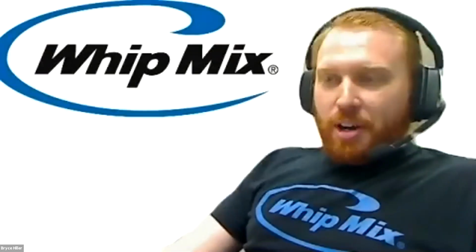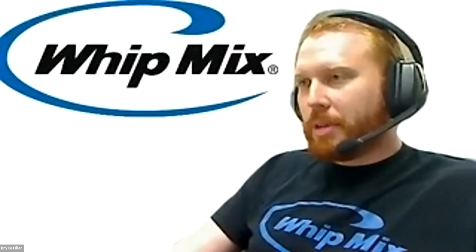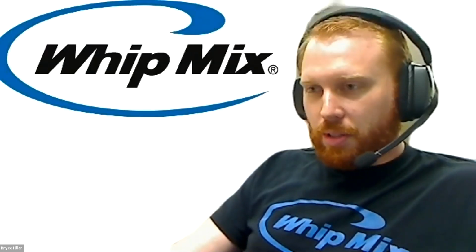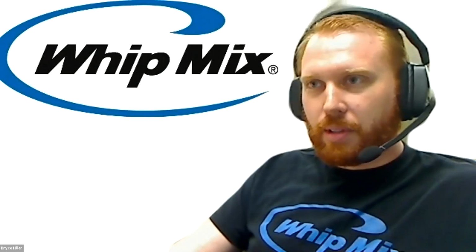All right, so I'm going to go ahead and share my screen. We're not going to talk about scanning today. In the past 2 months, we've probably gone over scanning like a dozen times. If you need to know how to scan something, we have a ton of webinars on that.